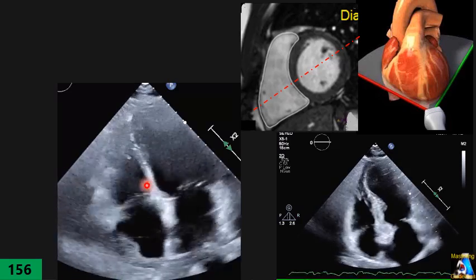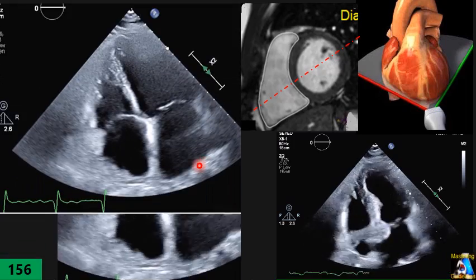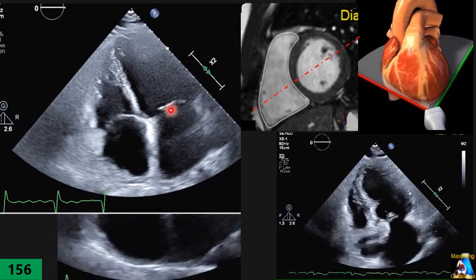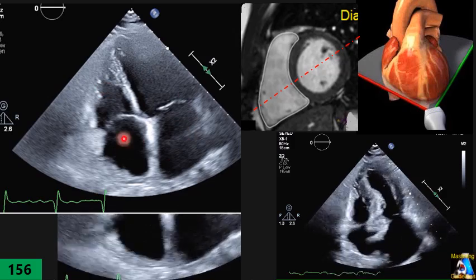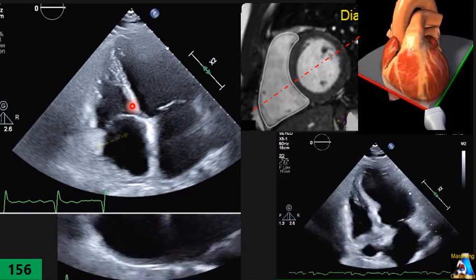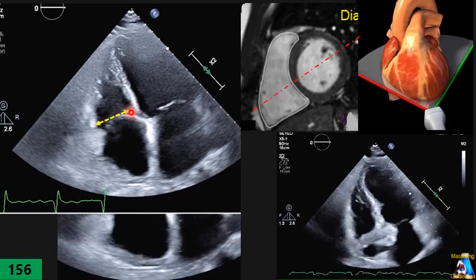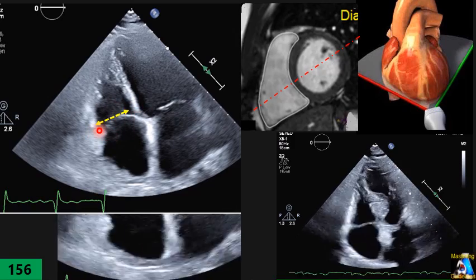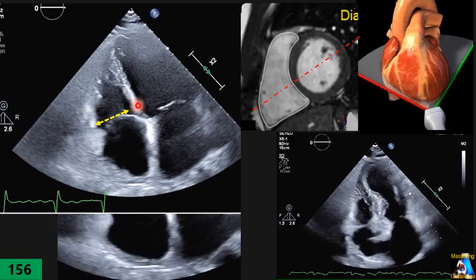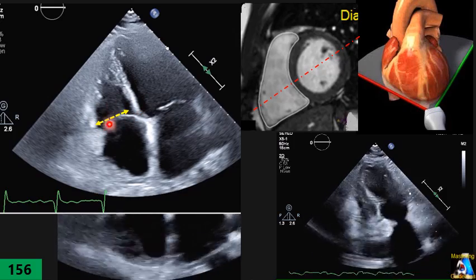When you determine your border, freeze it and cine loop to the end of diastole, which usually corresponds with the Q or R, when all valves are closed and all four chambers are at the largest diameter. Then you have to measure the basal diameter, that is the largest diameter close to the tricuspid annulus, sometimes next to the annulus, sometimes a little beyond, above that one, it doesn't matter. Go to the largest area that you can see close to the tricuspid annulus.